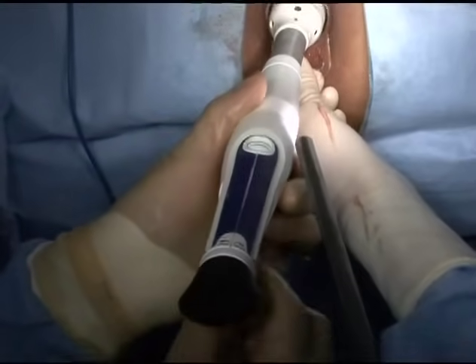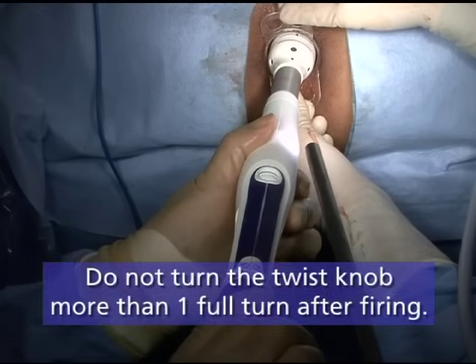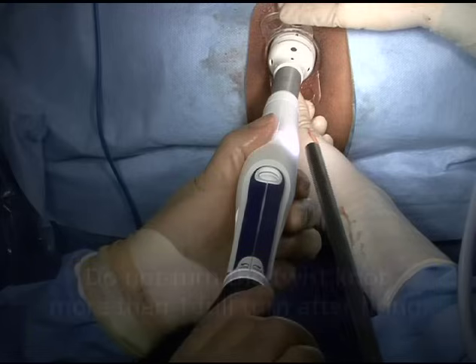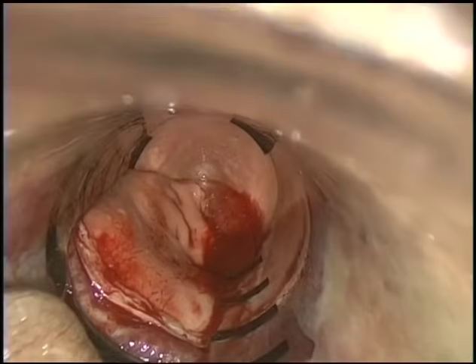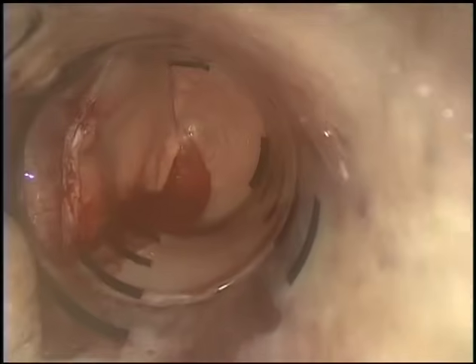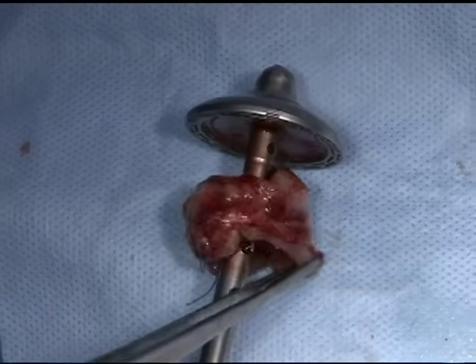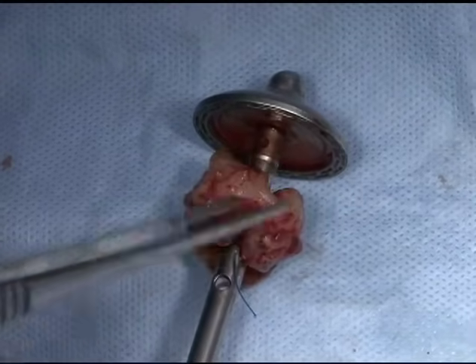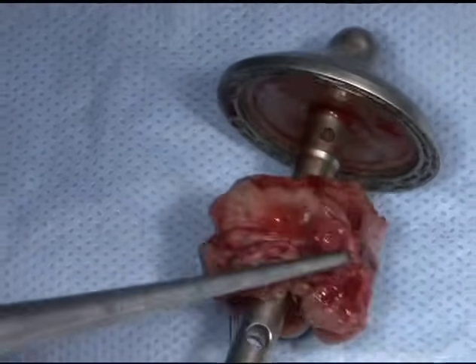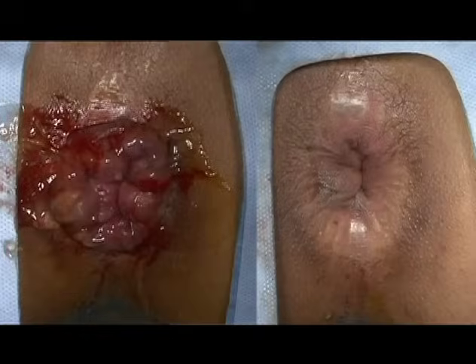Remove the instrument by turning the adjustment knob one full turn counterclockwise and gently extract from the patient. Do not turn the twist knob more than one full turn after firing, as doing so may result in difficulty removing the device or separation of the anvil assembly. Following removal, inspect the staple line for hemostasis and correct any residual bleeding with a suture. To inspect the tissue sample, turn the twist knob counterclockwise to fully open the instrument and inspect the tissue specimen to ensure that all desired tissue layers have been incorporated in the anastomosis. Remove the port from the anus and discard the device and all sharps per your institution's policies.